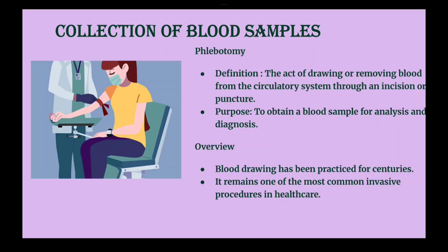Now, in today's class, we'll cover an important laboratory function: how to correctly collect blood samples and the anticoagulants that are used in hematology.